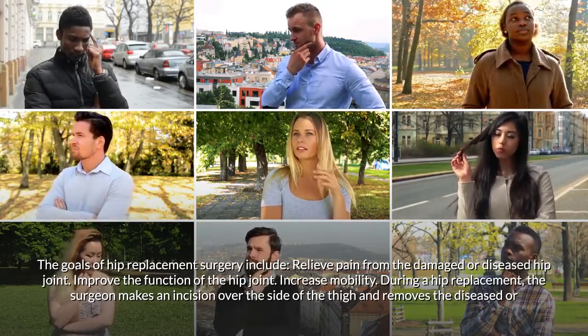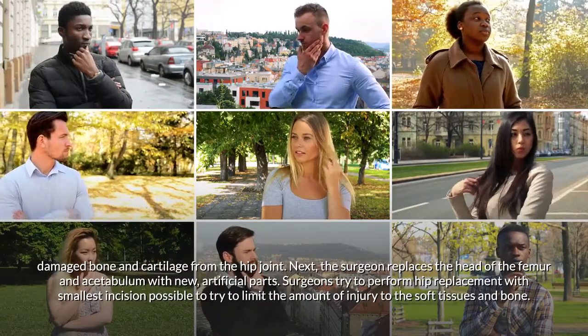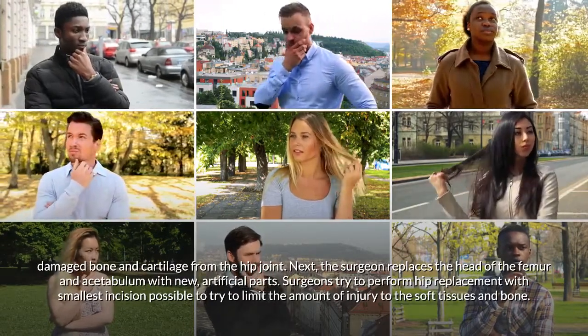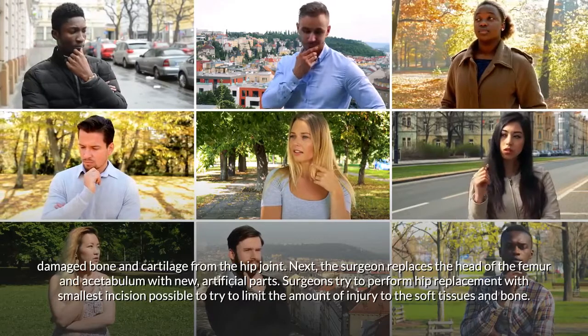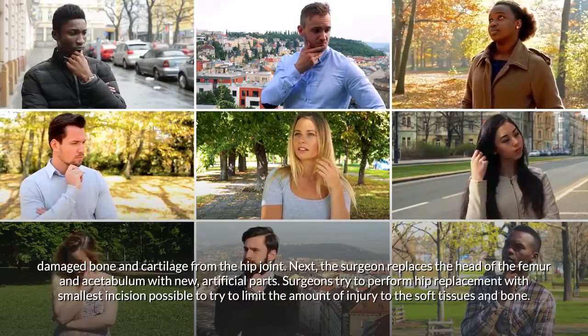The surgeon removes the diseased or damaged bone and cartilage from the hip joint, then replaces the head of the femur and the acetabulum with new artificial parts.